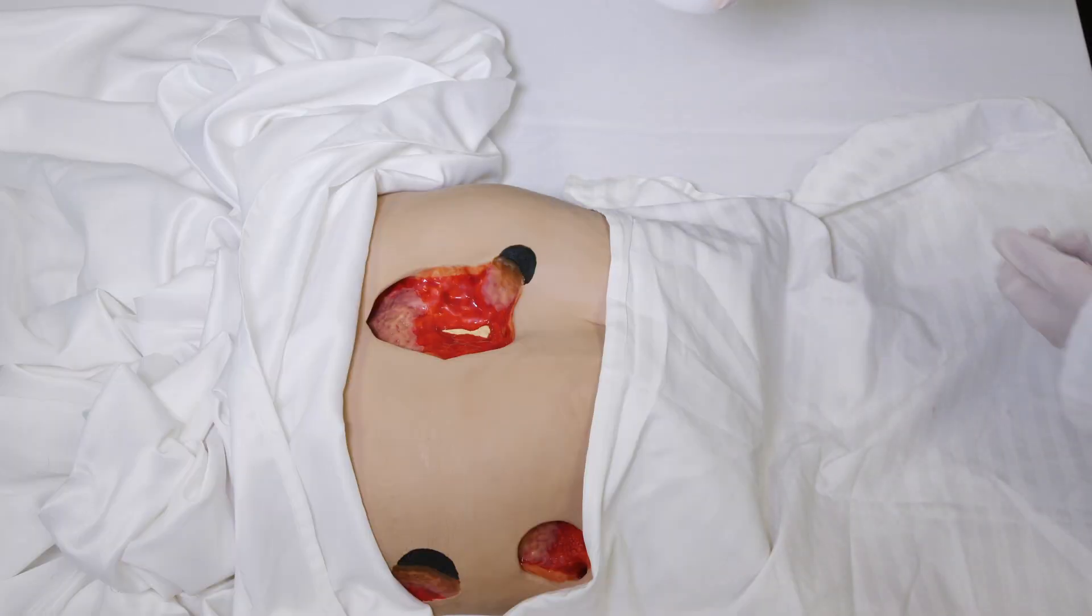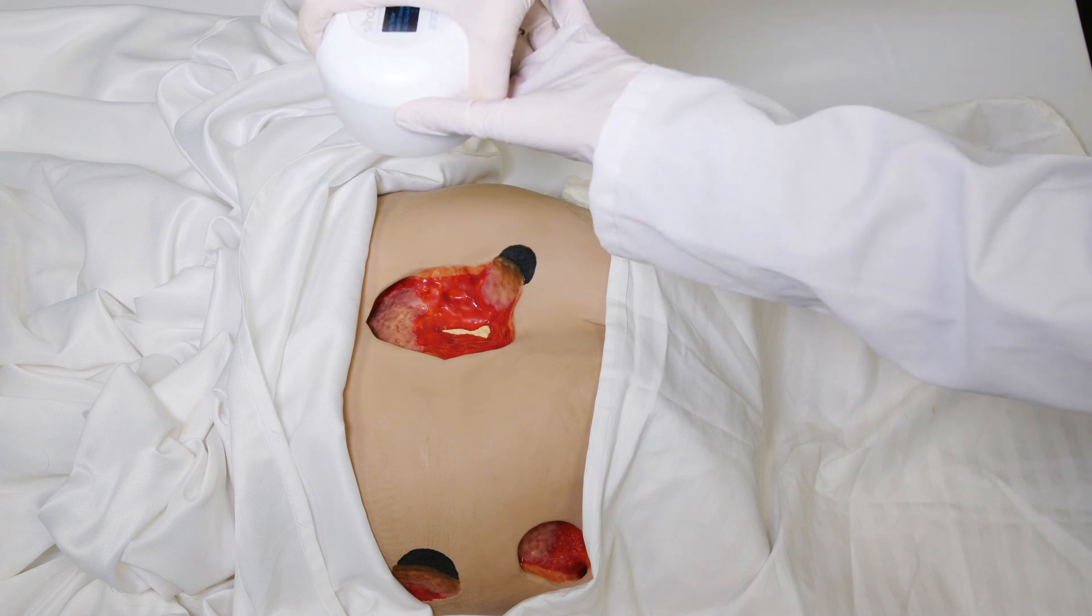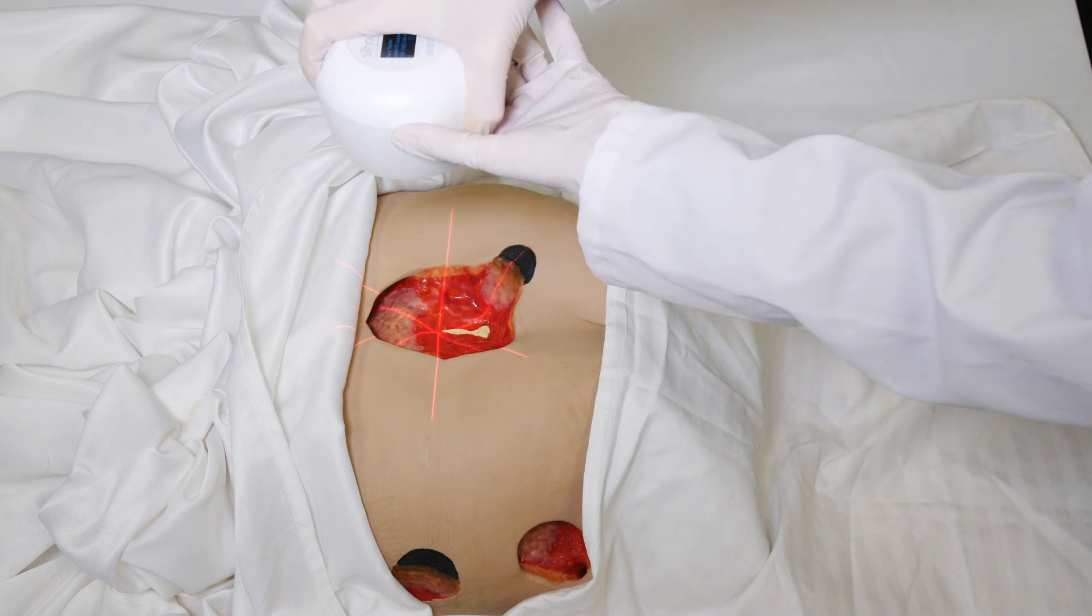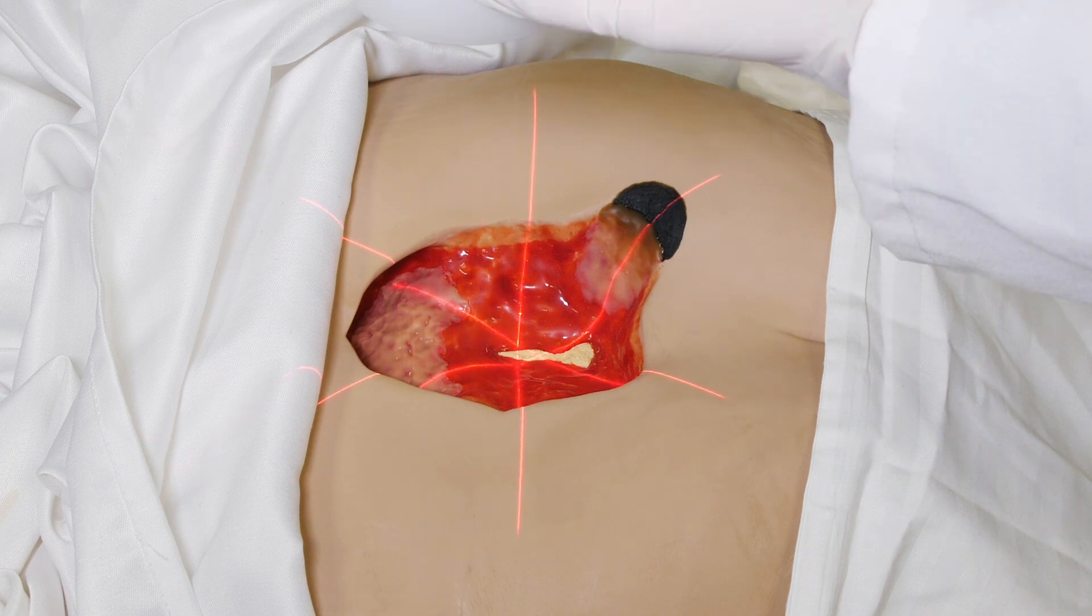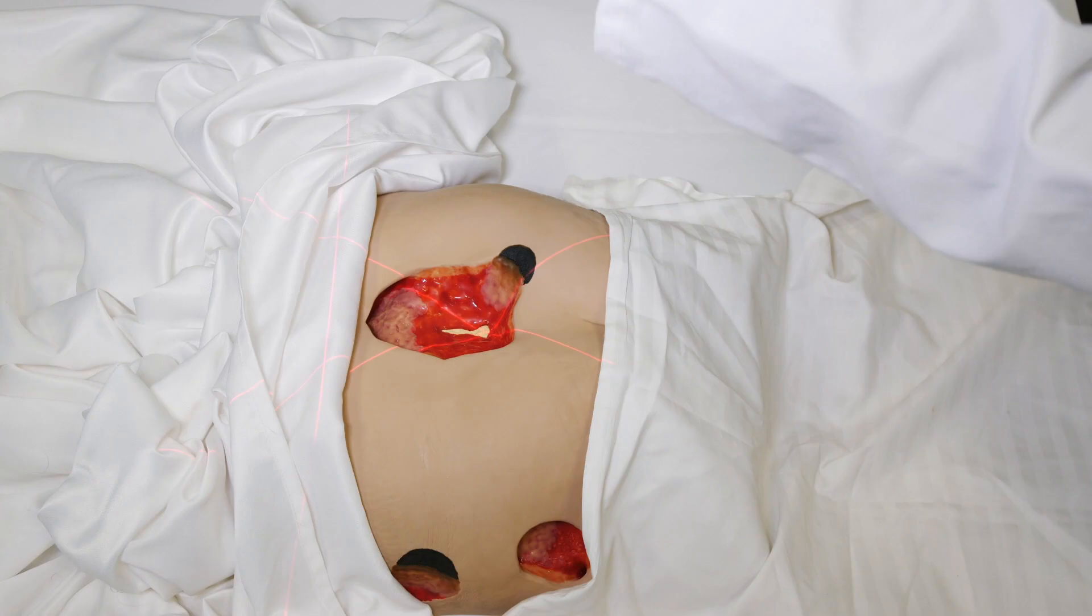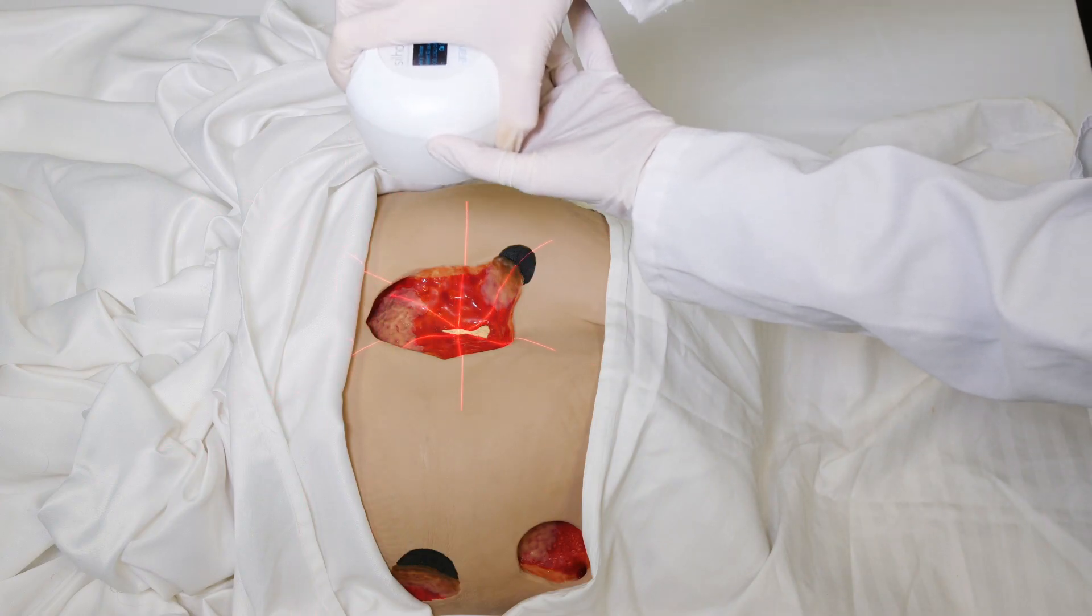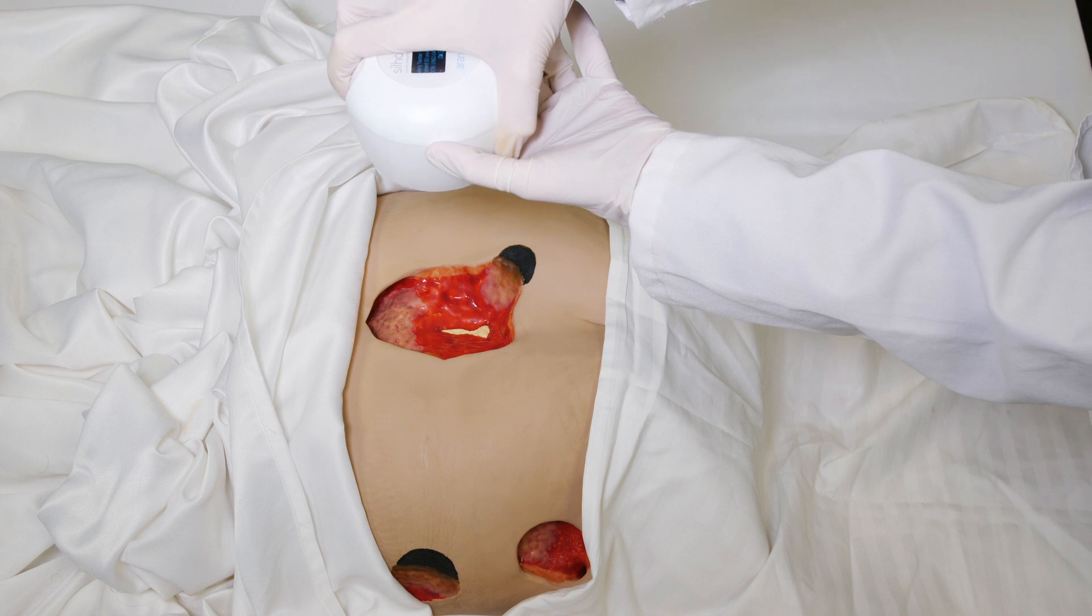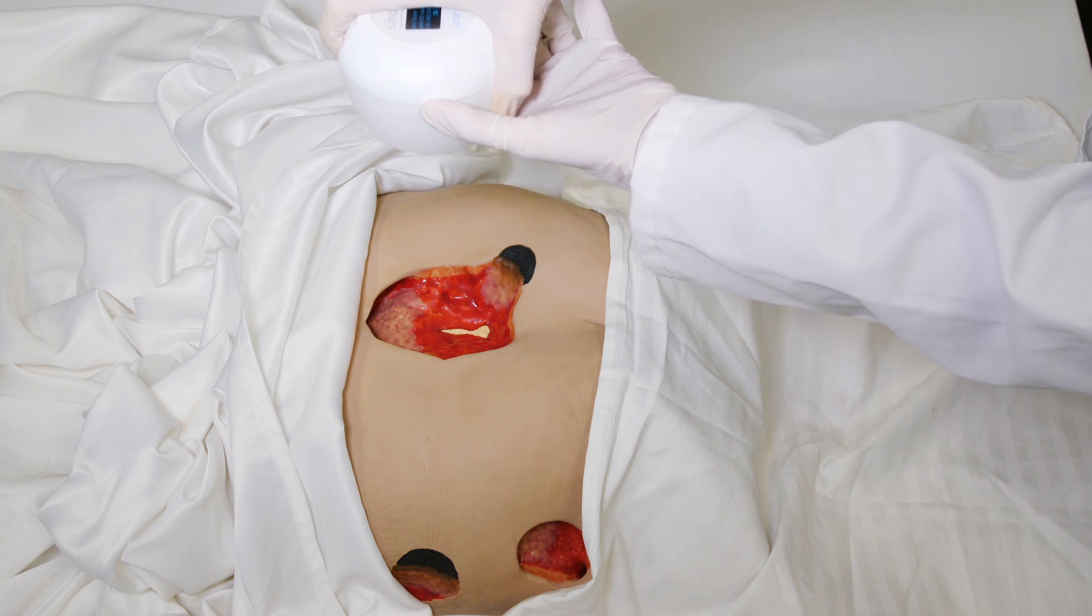To take images, hold the Silhouette Star directly over the wound. Press the capture button to show the three laser lines and position these to form a star across the deepest part of the wound. Press the button again to capture the images.